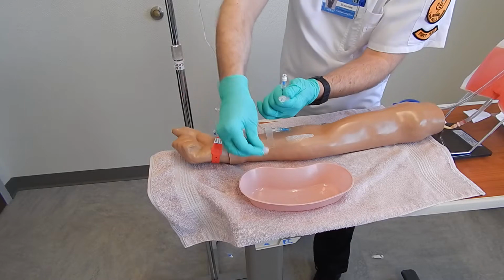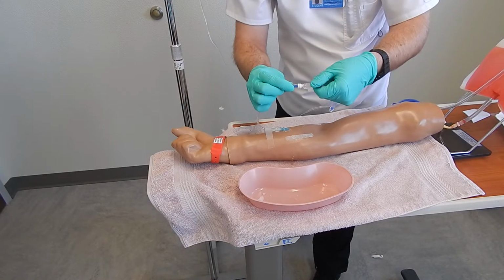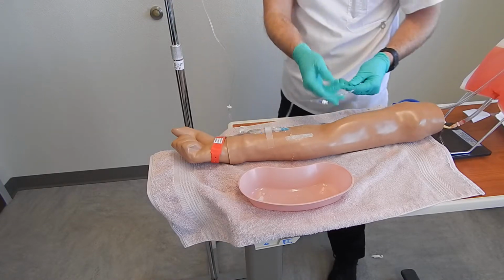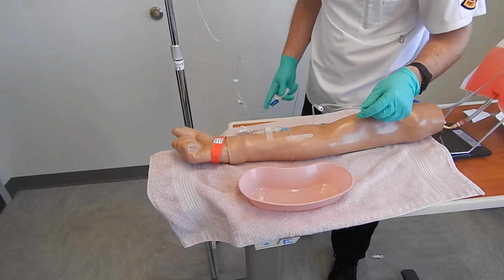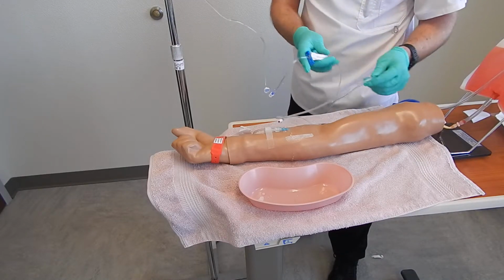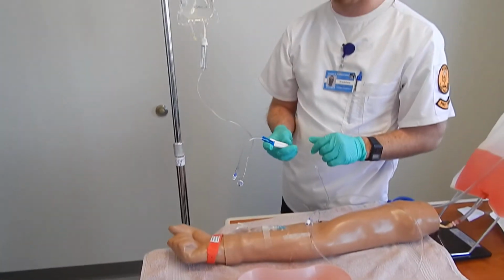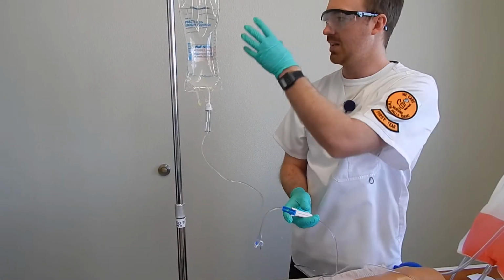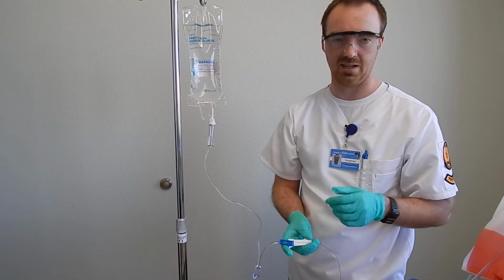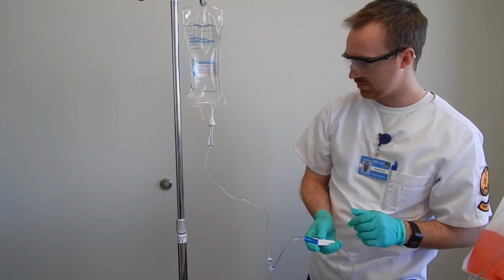Break this off the rest of the way. And go ahead and attach that, being careful not to touch the sides. And then I'll open this up. So I've done my med calculation for 31 drops a minute to get my bag to flow in over 8 hours. So I'll go ahead and set my drip rate.